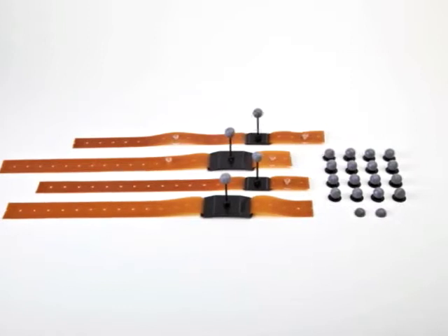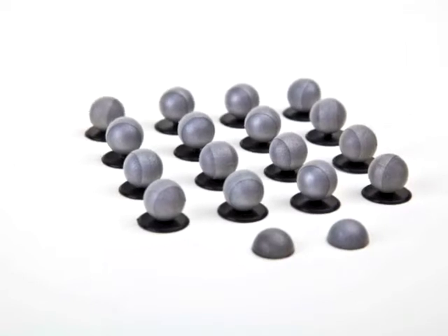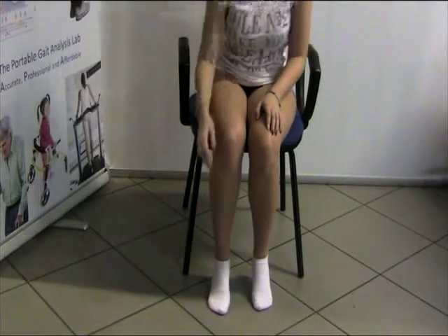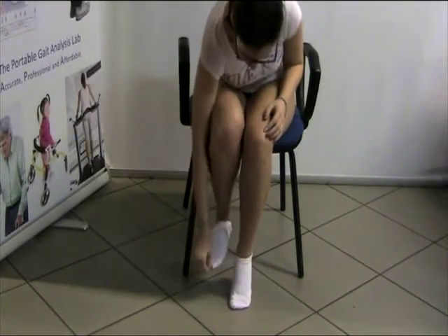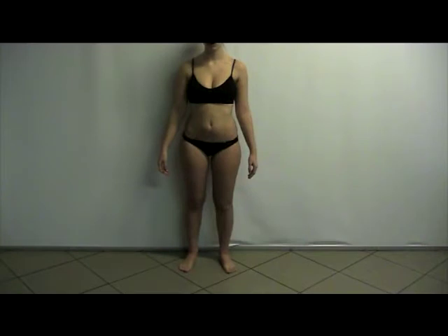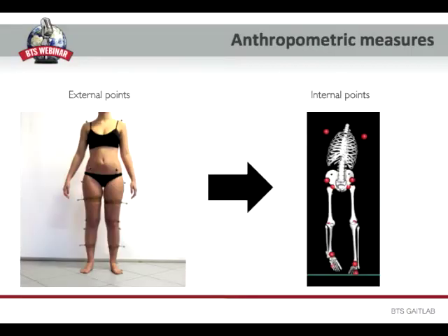The walking protocol we are using is the Davis protocol, which employs 22 markers to be placed at specific points on the patient's body. The patient has to be undressed so that the body sections on which we are applying the markers are well visible and uncovered. The markers should be integral to the subject as much as possible so that they can follow completely his movement. Before starting with the real preparation phase, it's necessary to take some anthropometric measures of the patient that will be used to define the joint centers of rotation during the processing phase.